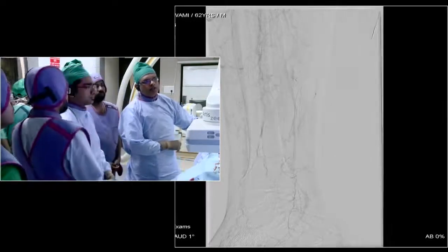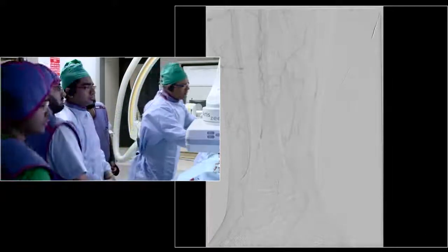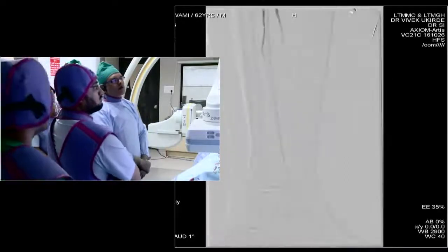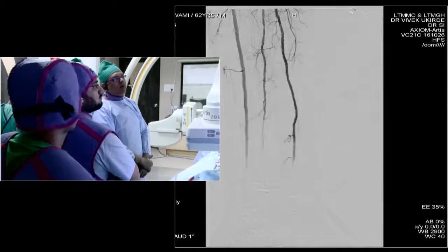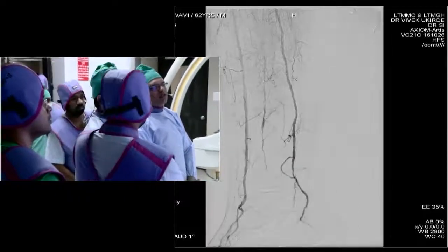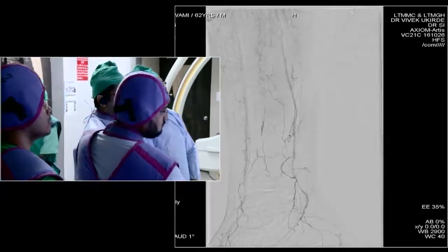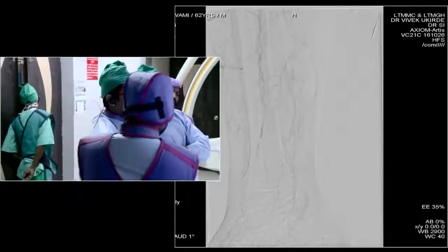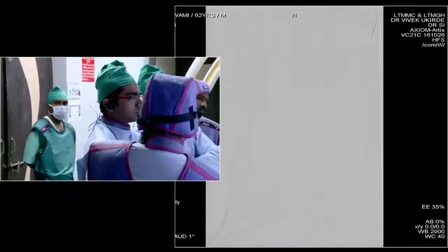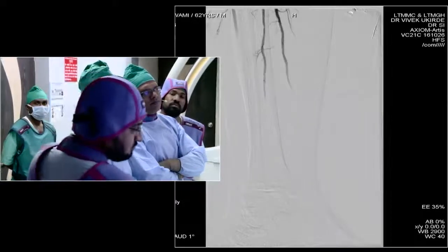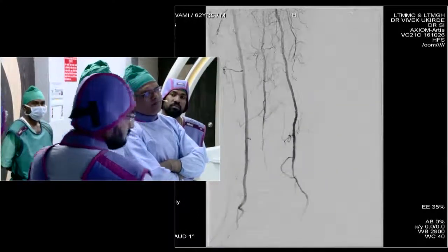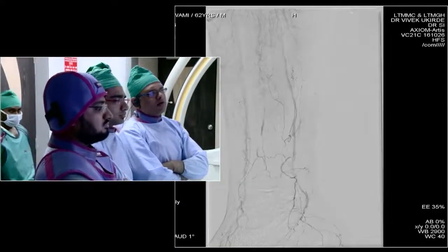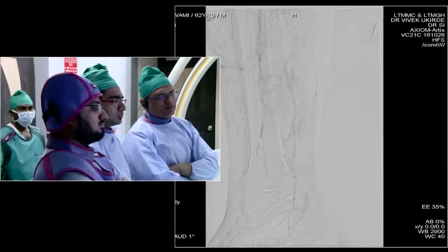I think the area we angioplastied is open well. Distally we need to figure out what to do — the plan is to wait at this stage. Maybe we will see him again to decide whether to reconstruct the plantar arch in a second setting. The plantar branches are filling up, including the calcaneal branches, and with improved pressure head there should be improvement in flow in these branches also.